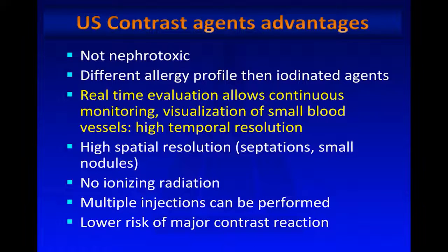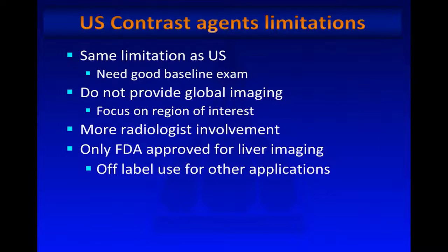You can perform multiple injections as long as you stay within the 5 cc limit. And typically, an injection for a liver will be 2.5 cc, so you can do at least 2 injections. And there is, again, a lower risk of major contrast reaction. There are, however, limitations, and basically they're the same limitations as of ultrasound.